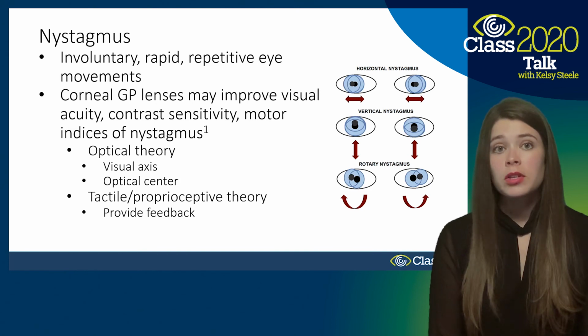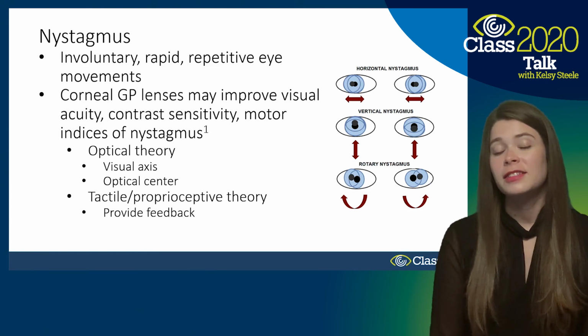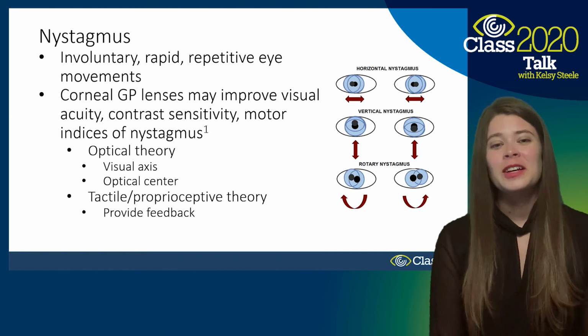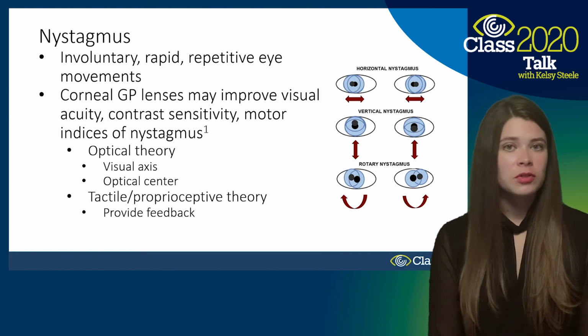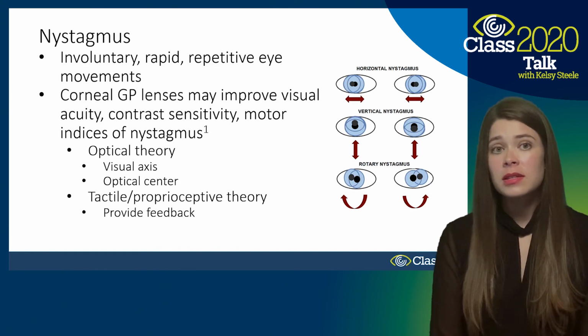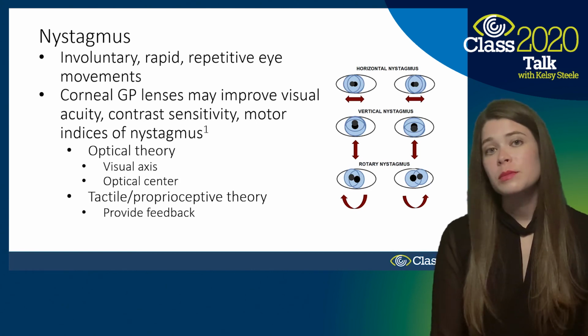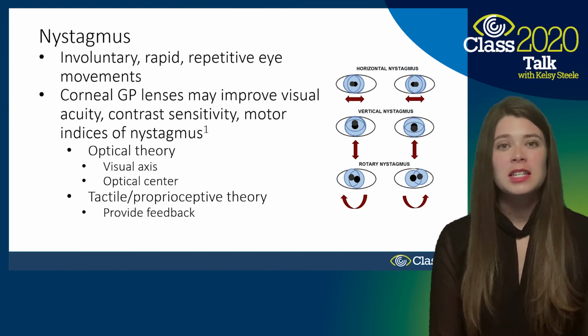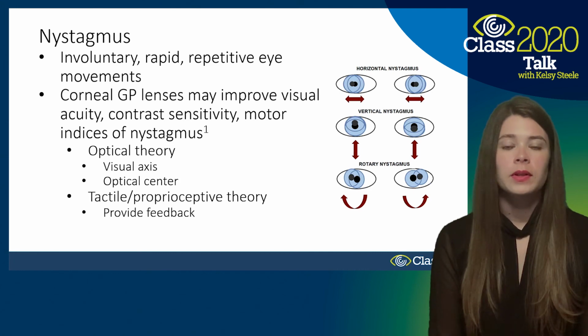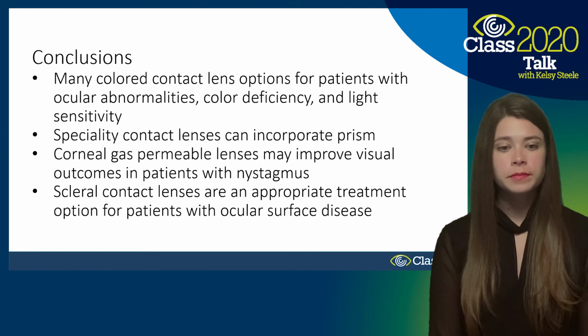And I've seen this with patients that they do a little bit better, especially kiddos, with a corneal GP than they do in their glasses. It is a little bit more of a challenging fit. You can't really get a keratometry value. The insertion and removal training is a little bit trickier too, but they can do it. I've had little kids do this and be really successful with these. So as long as they're motivated, you have a nice patient technician or yourself that's teaching them, they can be very successful. And like I said, get even better outcomes than they would from their glasses.